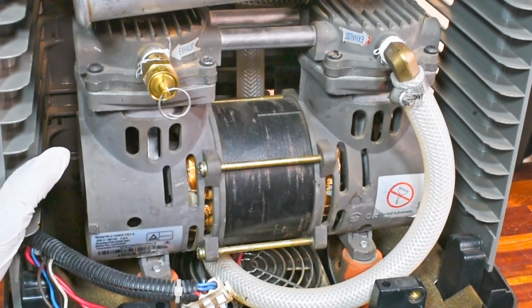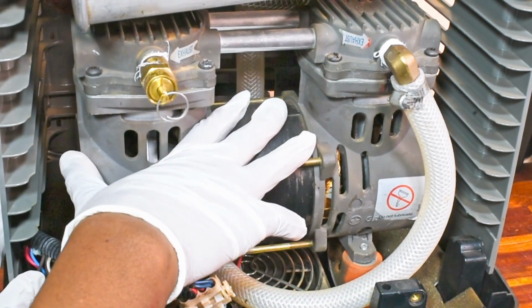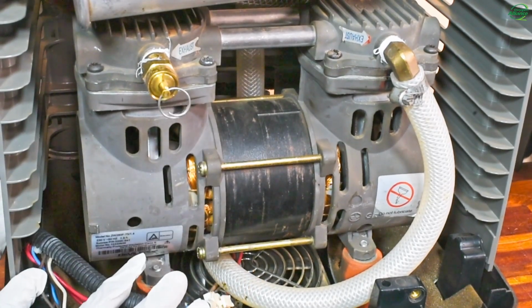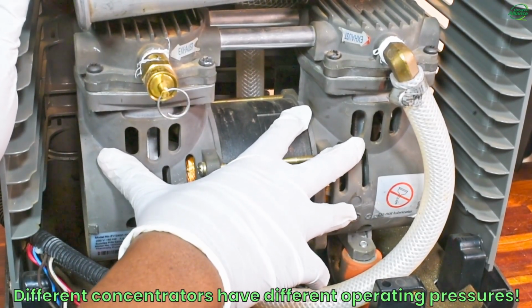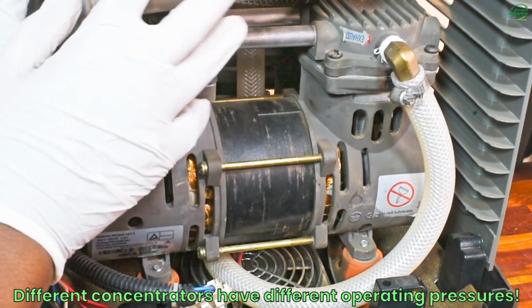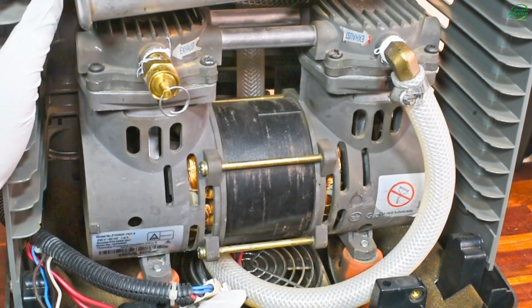The last cause of low oxygen purity is a worn-out compressor kit. The compressor is responsible for generating sufficient air pressure required for effective PSA cycles. For this oxygen concentrator, it is expected that the compressor should be able to generate pressure to around 40 psi, which is the operating pressure for the concentrator. Failure for the compressor to generate this pressure can cause low oxygen purity.